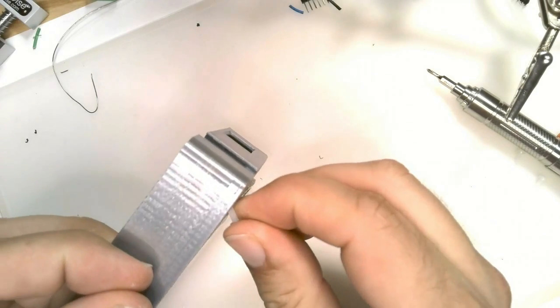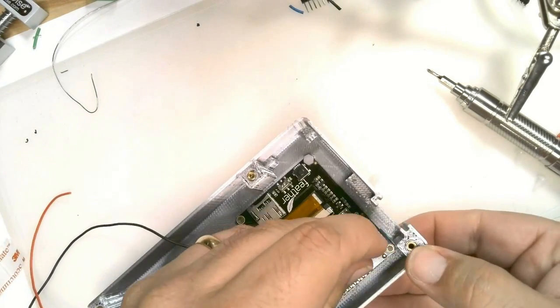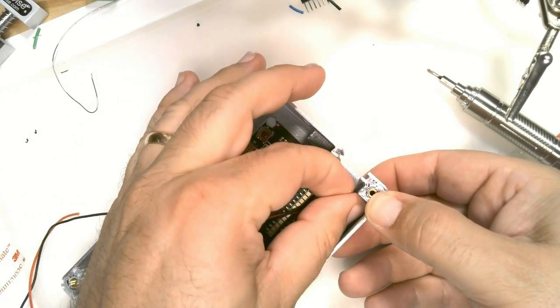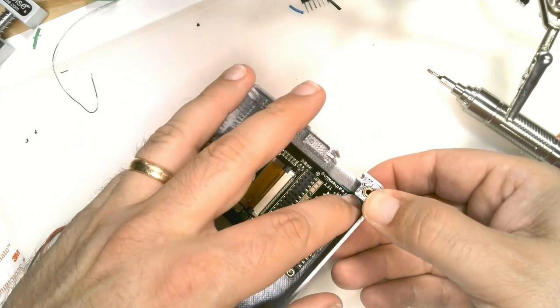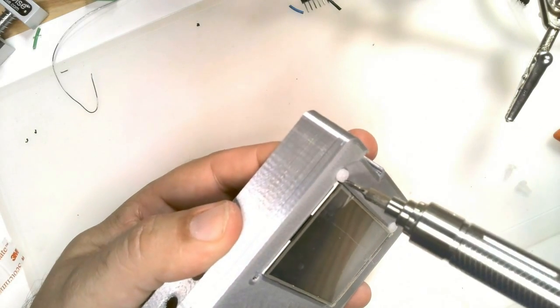Now it's time to mount all of the parts in the case. We first attach the TFT display board using M2.5 screws and nuts. We've temporarily removed the feather board so it's easier to reach the nuts.